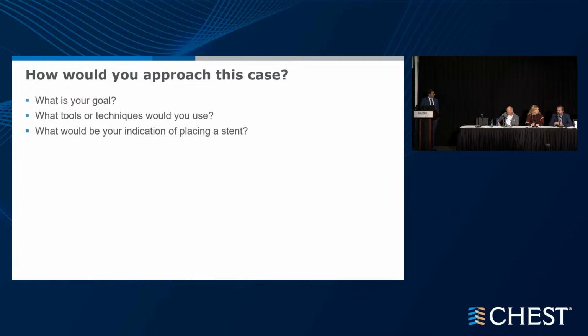Okay. I mean, the other thing I think about here is how long this lung has been down. If you got really hypoxemic in a procedure, then it suggests there's shunt and there must still be some flow. With contrasted scans, I'm getting more of them for these complete obstruction cases where I don't know the duration of how long the lung's been down. I don't know what I should be doing necessarily with that scan. But when I see no flow going to parts of the lung that I could potentially open, I wonder more about whether I'm going to do any good. In this case, clearly hypoxemic from a shunt. Sure, you could do some good.